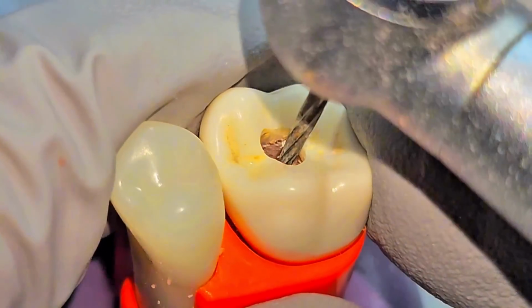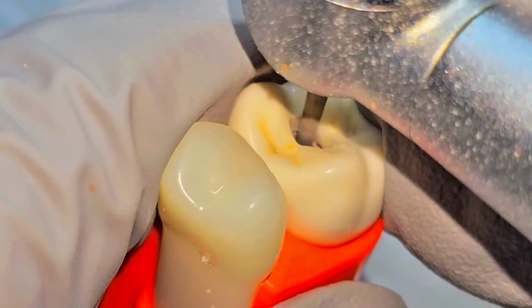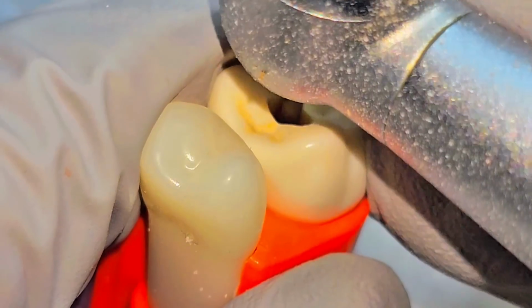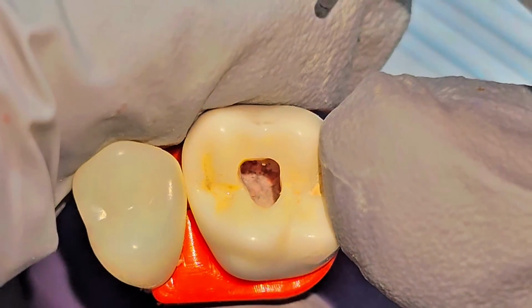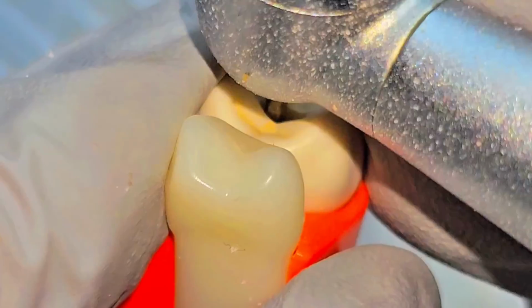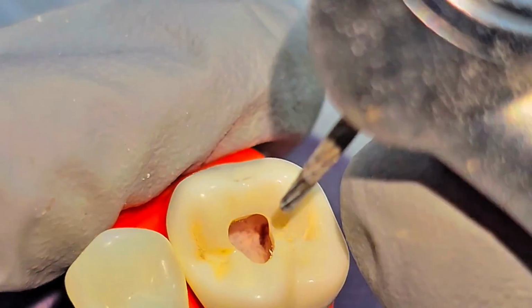I made it more visual, and I'm going to make it more triangular. Always move, work and check, work and check. Don't go too aggressively at once, assuming, because as you can see, I cannot see the tooth at all. So engage, work and check.